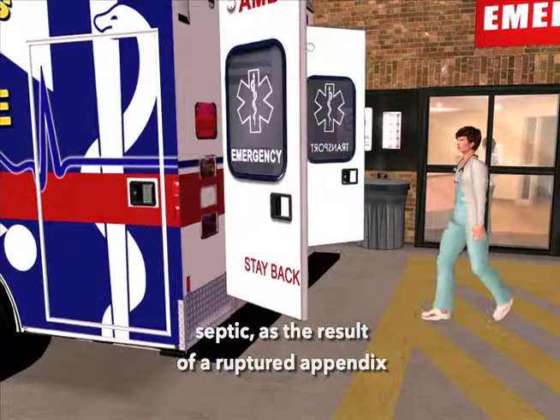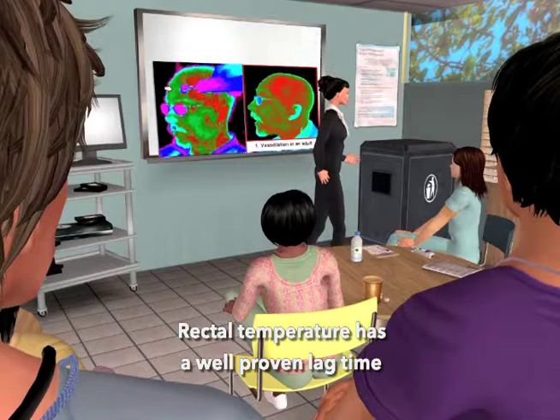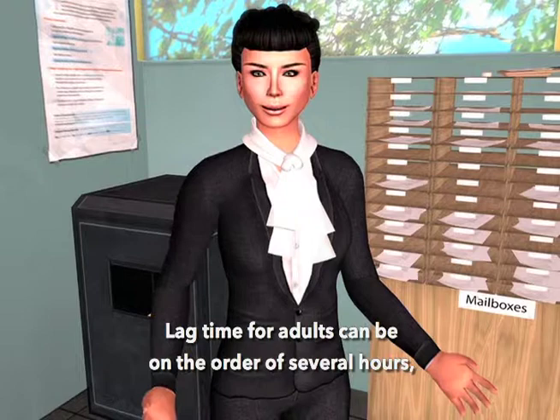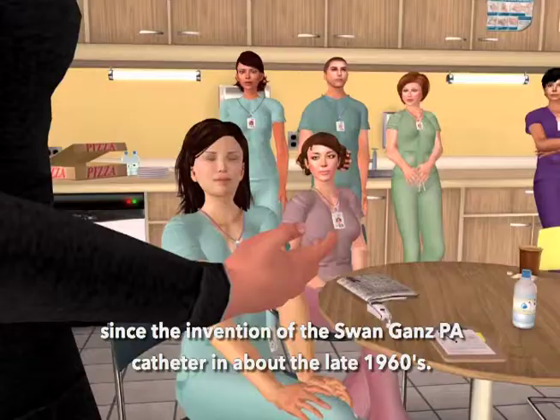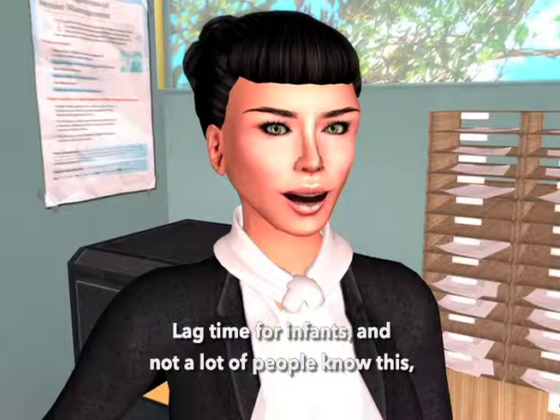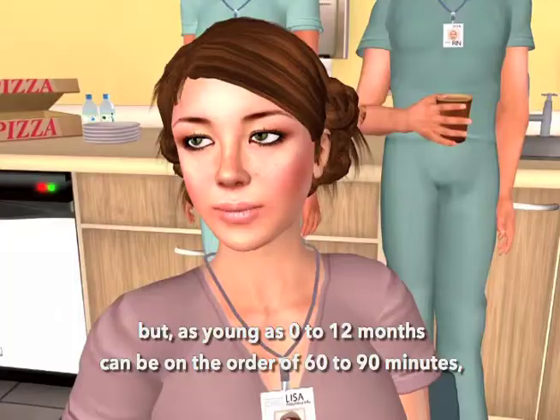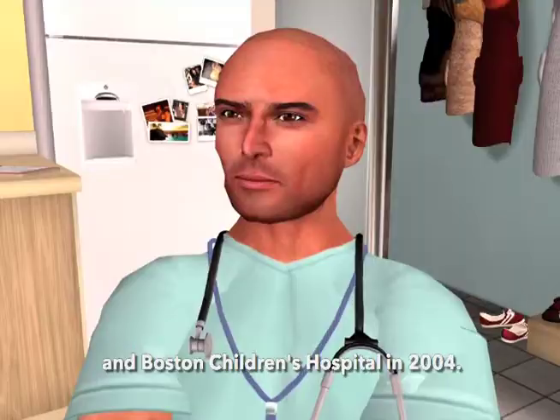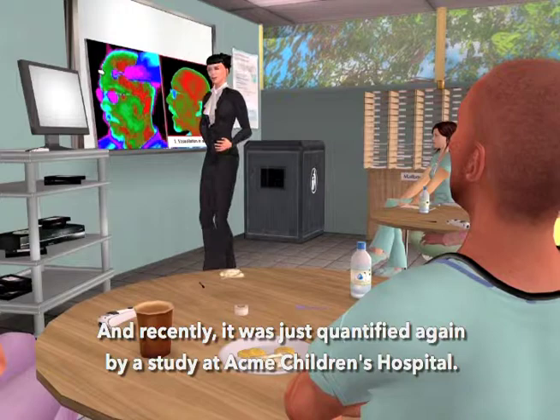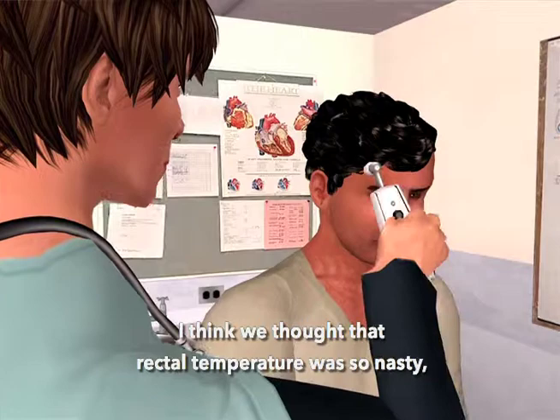Rectal temperature has a well-proven lag time in responding to a rapidly changing temperature. Lag time for adults can be on the order of several hours, and this is well documented since the invention of the Swan-Ganz PA catheter in the late 1960s. Lag time for infants as young as zero to 12 months can be on the order of 60 to 90 minutes, first quantified by Harvard Medical School and Boston Children's Hospital in 2004, and recently confirmed again by a study at Akron Children's Hospital. It's important not to believe the rectal temperature over temporal artery temperature if they differ.